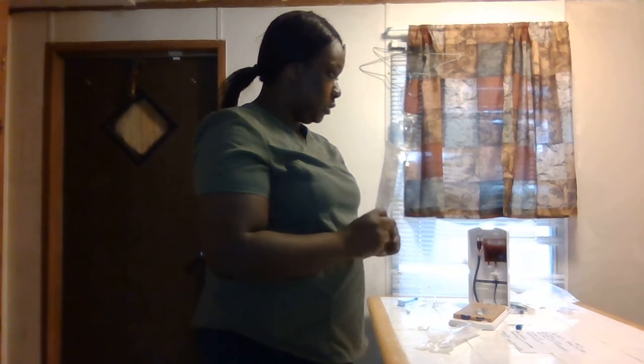Okay, again, we review our MAR, make sure we have the right patient, med, dose, make sure it's the right time, make sure it's the right route, which is going to be IV. Our three medication label comparison: John Smith, date of birth, Kefsol 75 milligrams, Kefsol 75 milligrams. And again, I did my drug dosage calculation, and I'm going to set it at 60 mLs an hour. Okay, and I believe I'm ready to open it up.